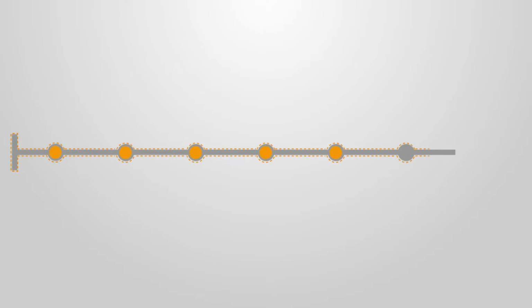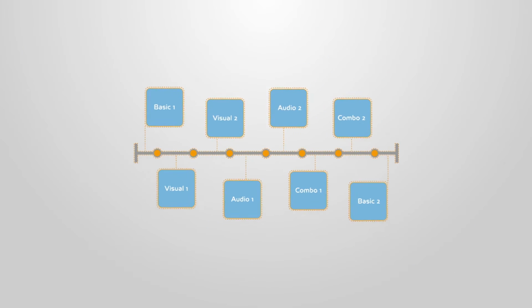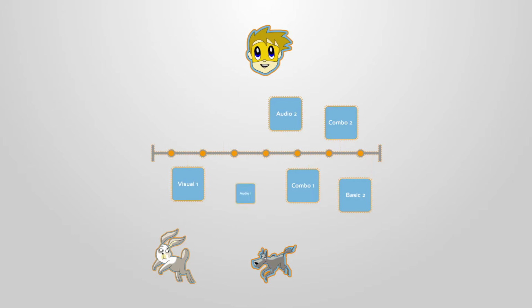The test is divided into 8 consecutive levels. The levels differ from each other in the type of their distractors. All levels contain target and non-target elements appearing in the same pattern in the center of the screen. Let's zoom in and take a look at a segment from the test.